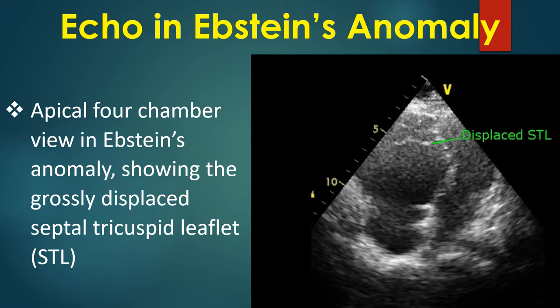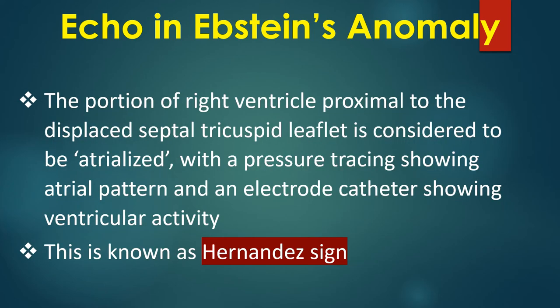Apical 4-chamber view in Epstein's anomaly showing the grossly displaced septal tricuspid leaflet. Normal distance between the septal attachments of the septal tricuspid leaflet and anterior mitral leaflet is only about 5 mm. The portion of the right ventricle proximal to the displaced septal tricuspid leaflet is considered to be atrialized, with a pressure tracing showing atrial pattern and an electrode catheter showing ventricular activity. This is known as Hernandes sign.